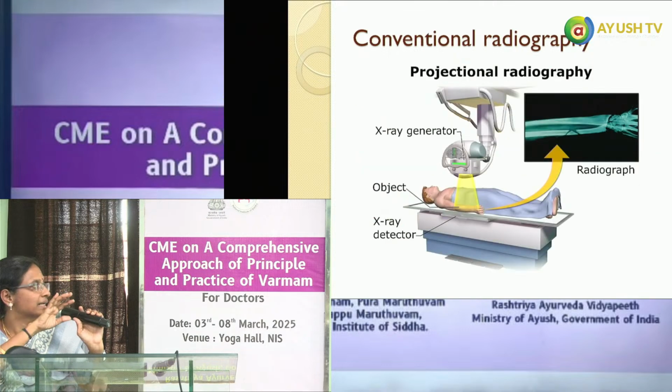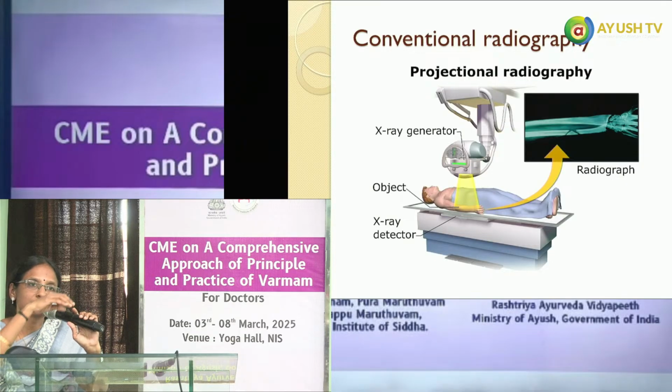So that's a pictorial representation. At the top is the X-ray tube. There the process called electron emission happens. And the yellow beam is the X-ray beam that is falling on the patient. The X-ray beam is pointed at the patient's forearm. Where the X-ray detector is placed, below the X-ray table there will be a tray. In that tray we will place the cassette. So this radiation passes from the patient's forearm into the cassette. After that they take the cassette away and process it. After processing we will get the radiograph or an X-ray. This is the process that happens in a conventional X-ray.